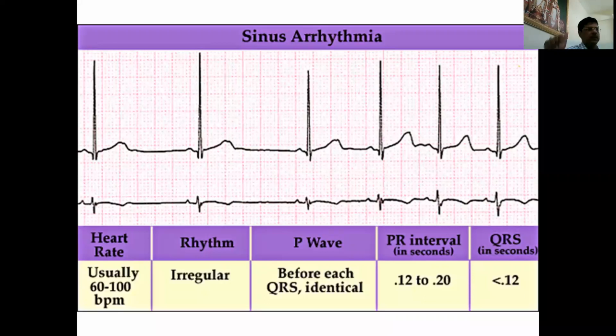Okay, right. Stop. So in the previous class, yesterday, we looked at the concept of dipole, and how that concept of dipole is responsible for the physiological basis of the ECG.